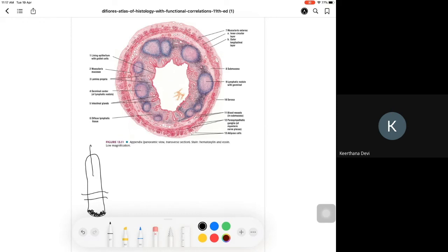And there is a carcinoid called goblet cell carcinoid. Now there is a name change there, goblet cell adenocarcinoma. That will be an incidental finding, and at that time they may want to know whether it is there in the margin or not. So you ink the margin and then take a section like that. Usually appendix, when you see histologically, will have 1 longitudinal section and 2 cross sections.